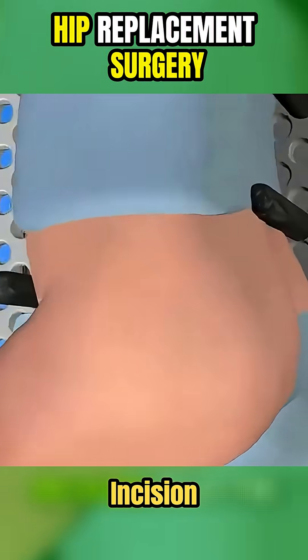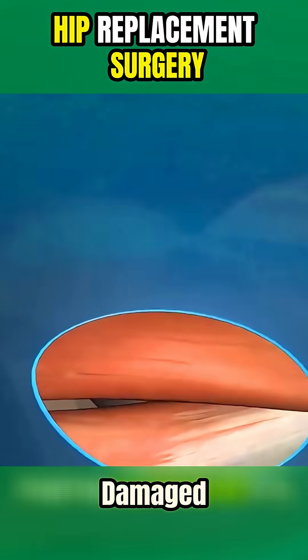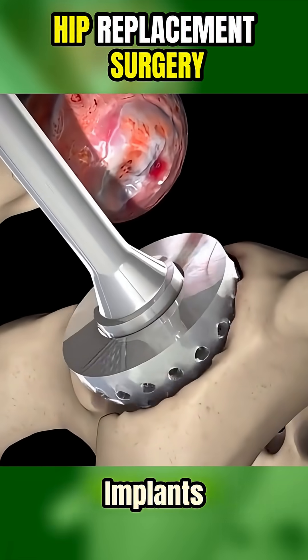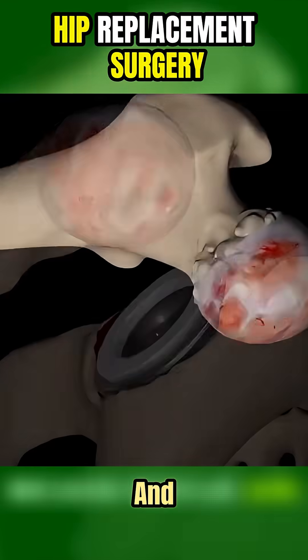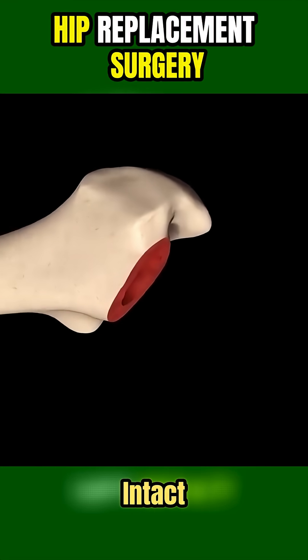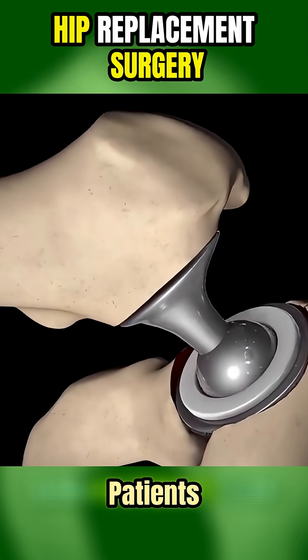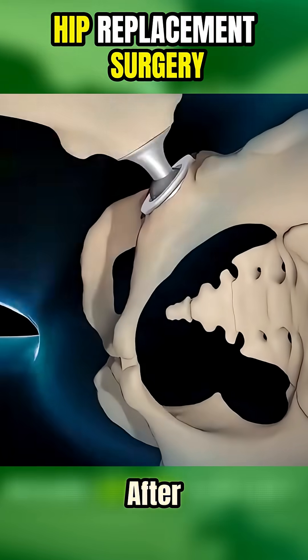Through a small incision near the top of the thigh, the damaged parts of the hip joint are carefully removed and replaced with implants. Because muscles and soft tissues are left intact, recovery is much faster, pain is reduced, and patients can often walk within hours after surgery.